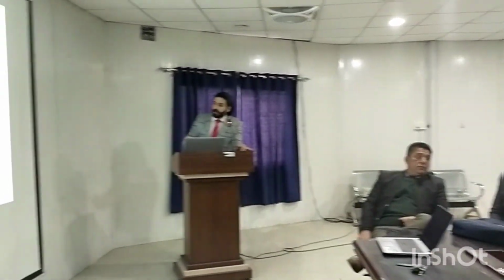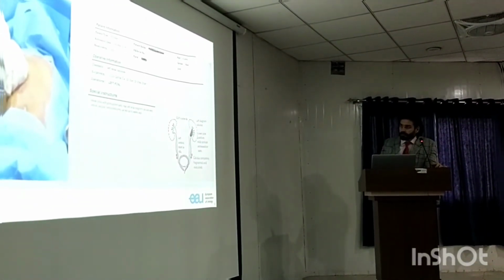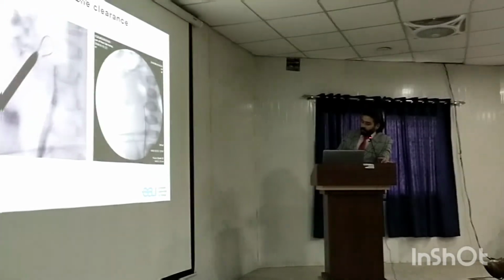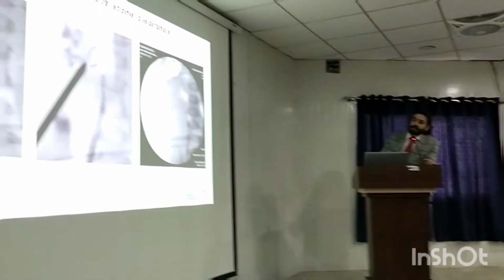Stone in the pelvis. This one is the ureter, the left staghorn calculus. Lower pole puncture was approached, then mild contrast extravasation was seen, and the calculus was completely fragmented and evacuated. Here you can see again the calicial system, the most lateral calyx was approached. This one is the LP needle of 18 gauge.